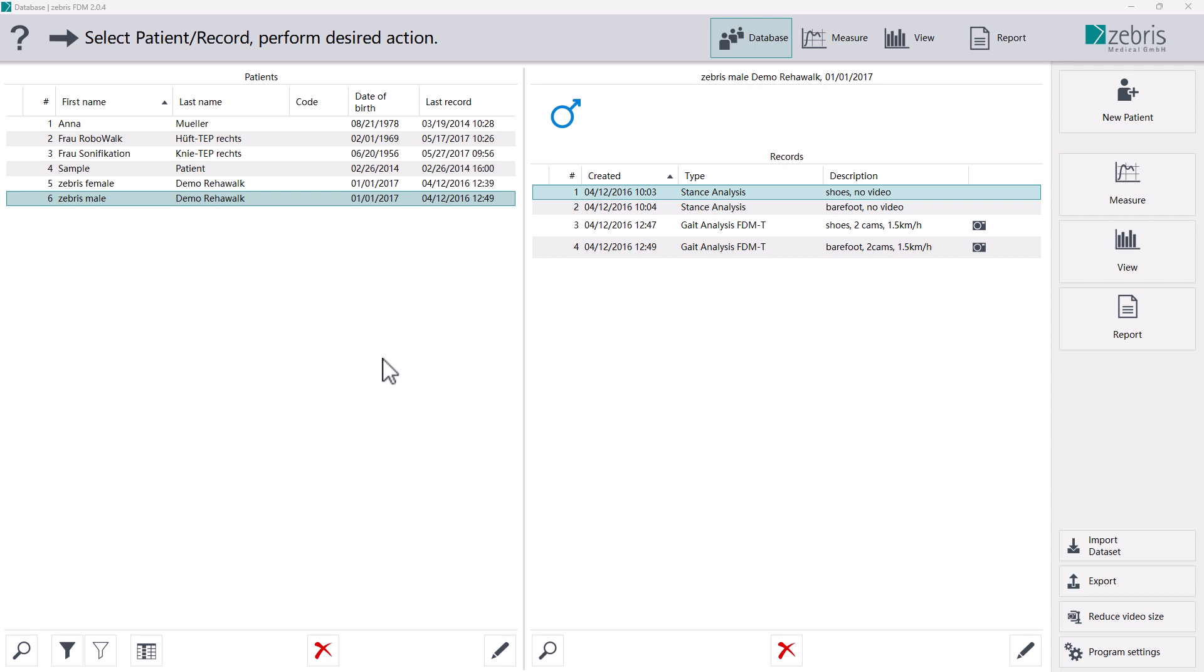Since video files can take up a lot of memory, there is an option in Zebris FDM software to reduce the file size of existing video recordings without noticeable loss of image quality. We have a manual and an automatic option.